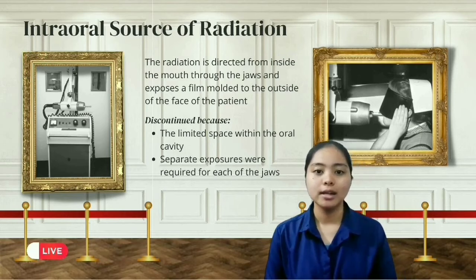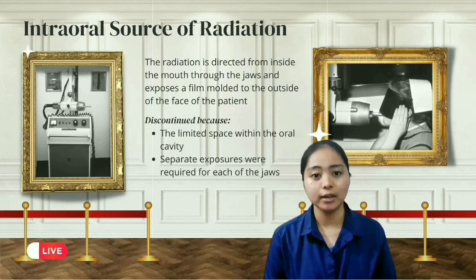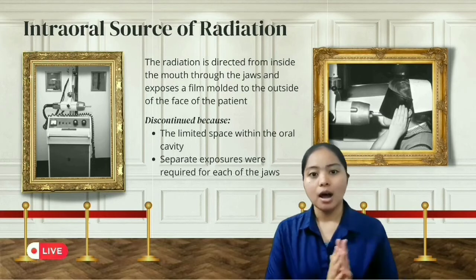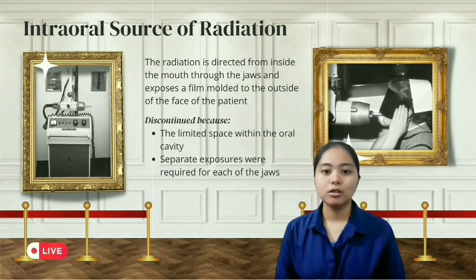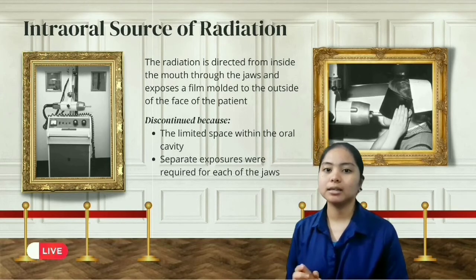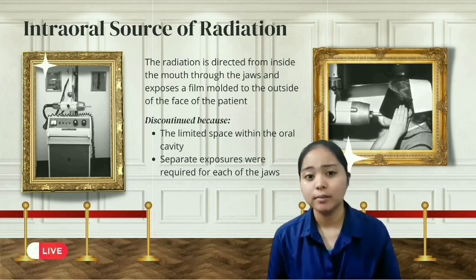as you can see, the film molded to the outside of the face of the patient, demonstrated by the exhibit here on my left. No screen or slow-speed screen films are used, and on my right is the exhibit of the intraoral panoramic unit.